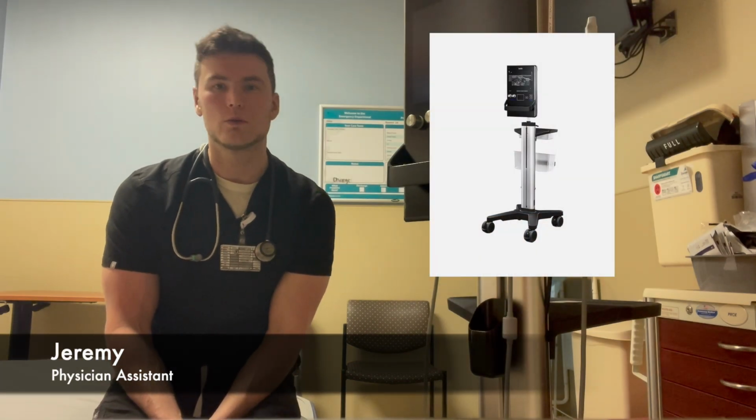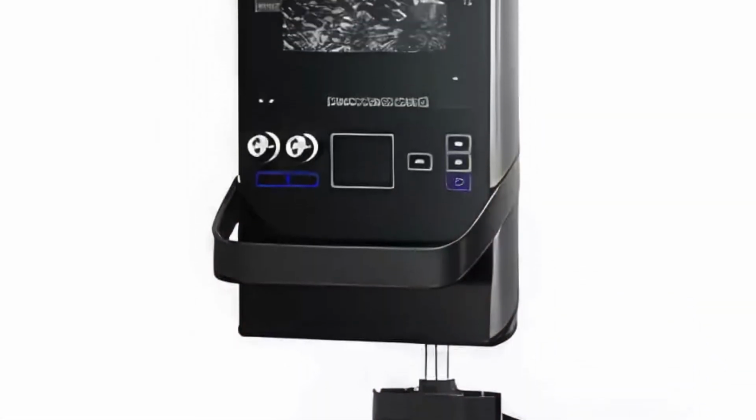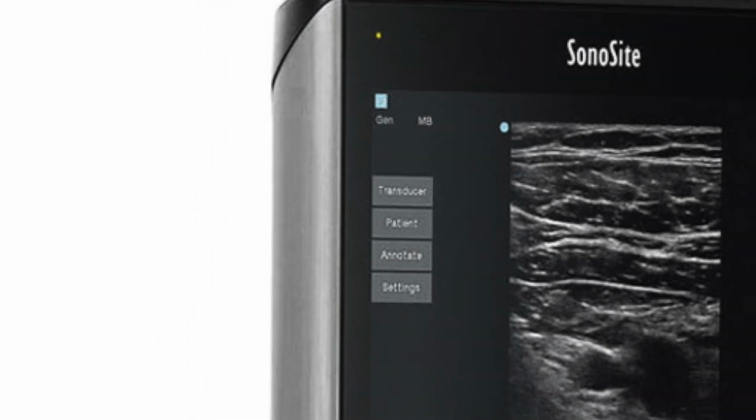My name is Jeremy. Today we're going to be utilizing ultrasound to identify an abscess. We're going to go over some basics of ultrasound. We're going to learn how to use it, what structures you need to identify and look out for, and how to perform this procedure safely.